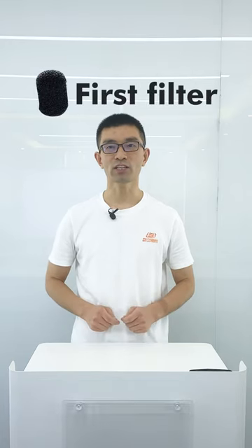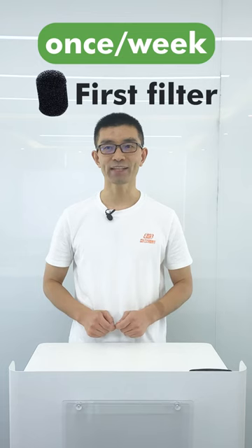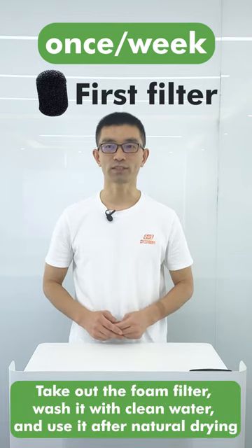The first filter should be cleaned once a week. When cleaning, take out the foam filter, wash it with clean water, and use it after natural drying.